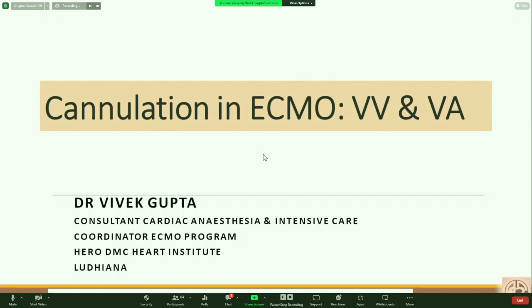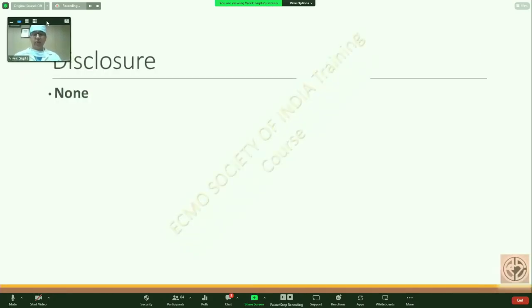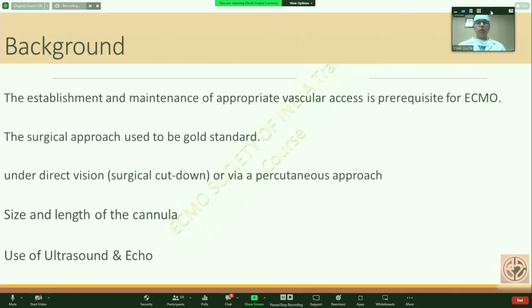Good evening, everybody. So I'll be talking on the cannulation and ECMO, our strategies in the VV ECMO and VA ECMO. I have nothing to disclose. If we talk about the cannulation, it's actually achieving a vascular access. This is a prerequisite for initiating an ECMO. If your access or your cannulation is not appropriate, then you cannot achieve that.